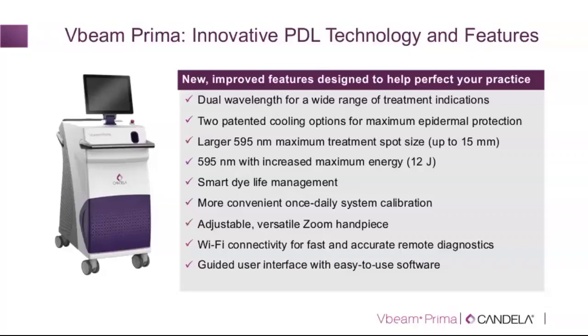There is also a relatively recent publication in the Journal of the European Academy of Dermatology and Venereology using the combination of the Vbeam Perfecta 595 and the Gentle YAG from Candela, the Nd:YAG, and the pulse dye laser in hemangiomas, where the thicker components of the hemangioma were treated with the 1064 and the flatter components with the 595. That was published, and therefore certainly the combination can be used. So in one single patient, there might be a deeper component that you can treat with the 1064 and a more superficial component that you can treat with the 595.